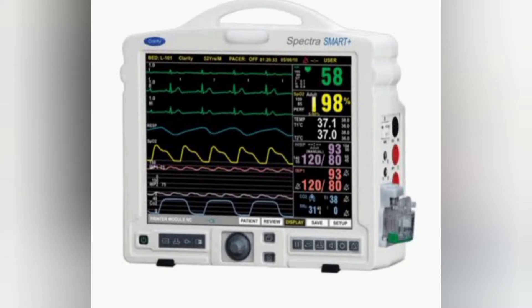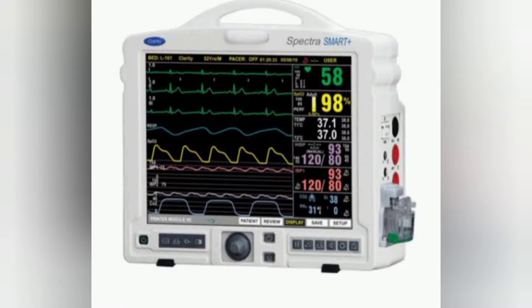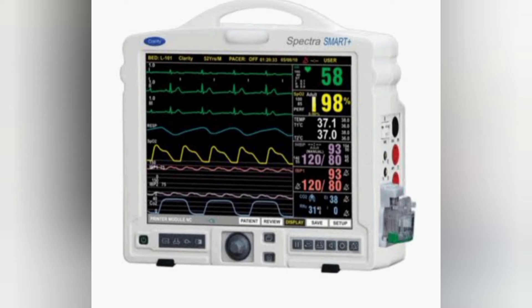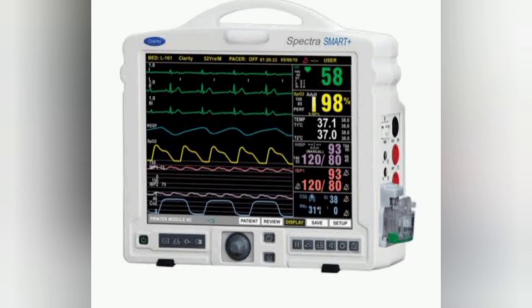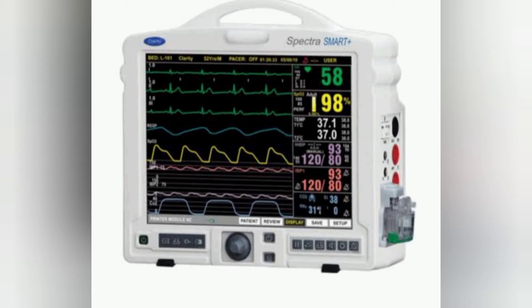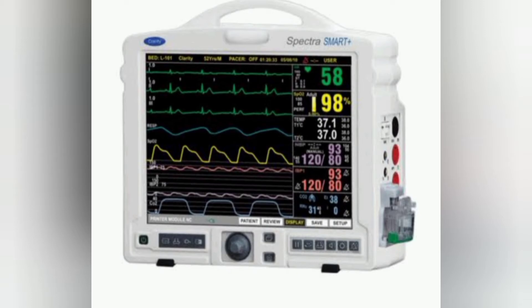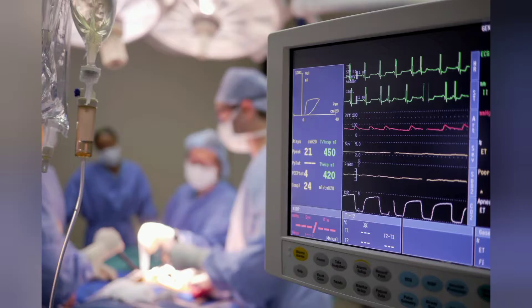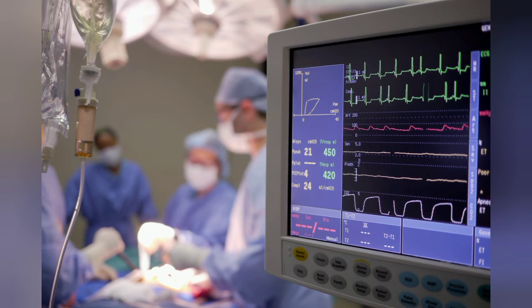The fourth OT equipment is the patient monitor. When a patient is undergoing any surgery, it becomes very essential to monitor vital parameters such as ECG, BP, SpO2, respiratory rate, and CO2. As the patient is unconscious, the clinical team monitors the changes happening in these vital parameters along with anesthetic agent monitoring through measurement of anesthetic gases.